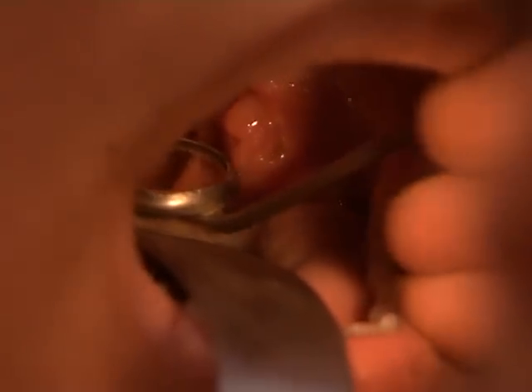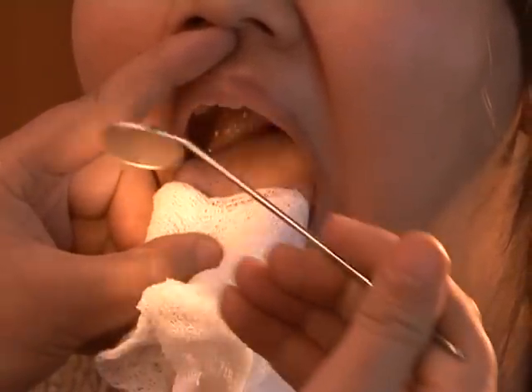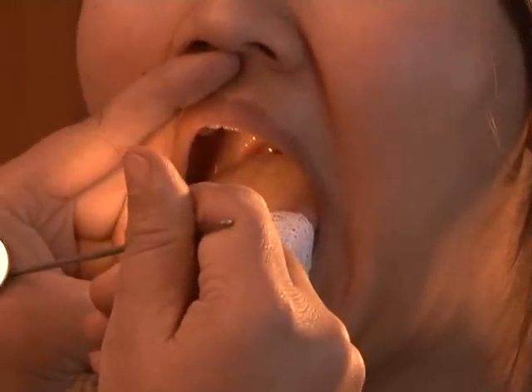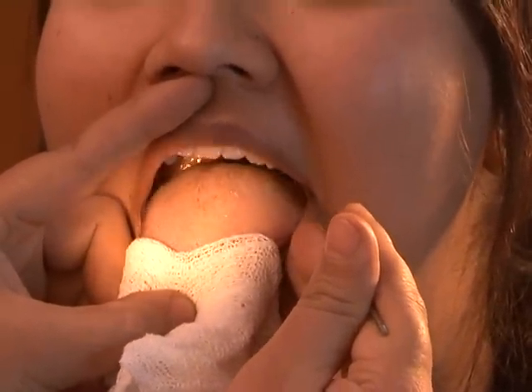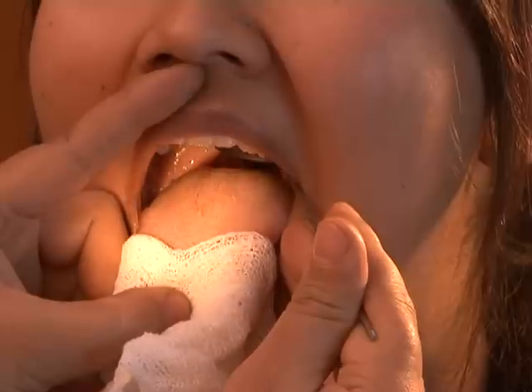To avoid inconvenience to the patient, posterior rhinoscopy and indirect laryngoscopic examination can be done in the same sitting using the same mirror. Indirect laryngoscopy is done with a plain mirror on a straight handle, held like a pen in the right hand with the glass pointing downwards. The mirror is warmed and temperature tested on the back of the hand. The patient sticks out the tongue, which is held with the middle finger and thumb, with the index finger on the upper lip. The mirror is introduced to the uvula, gently pushing it back to get a view of the larynx and piriform fossa. The patient is then asked to say 'A' or 'E'.